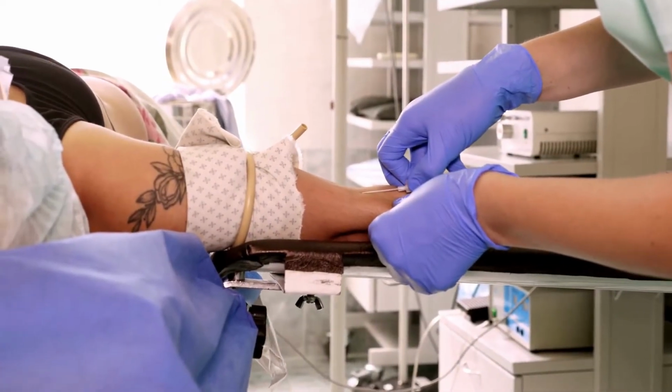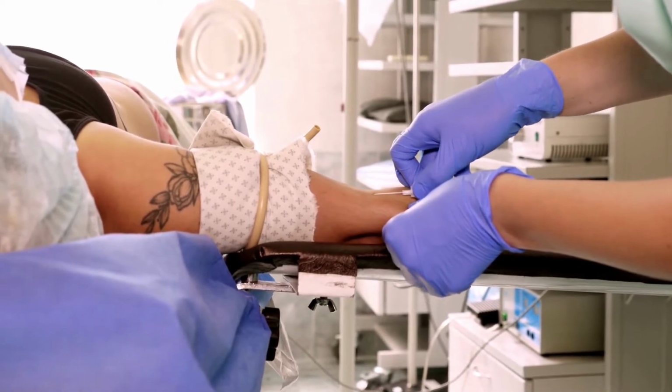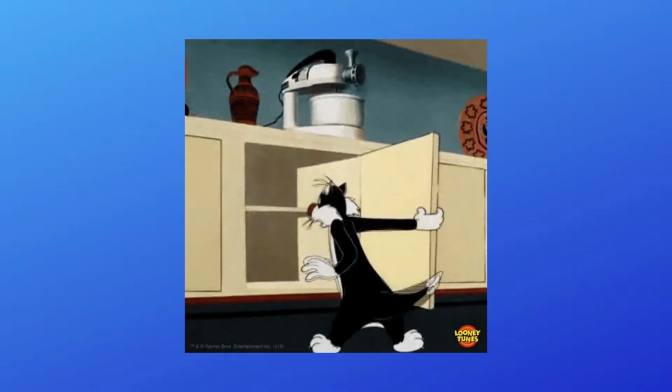So on the day of your infusion, well, actually, let's back up. Before your infusion, you will speak to most likely a nursing coordinator or a clinical nurse liaison. They'll ask you if you're allergic to anything. They'll talk about whether or not you've had somebody place an IV on you before and if they had any issues with getting a line on you. She's going to go through all of your supplies when she gets there to make sure she has everything she needs.